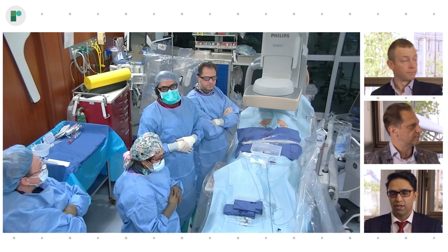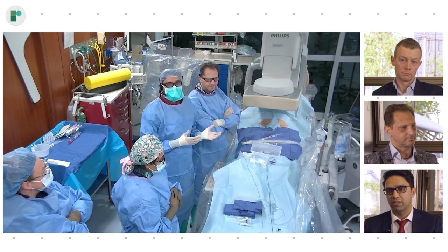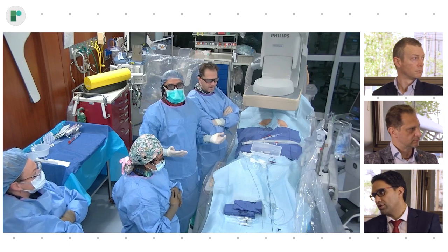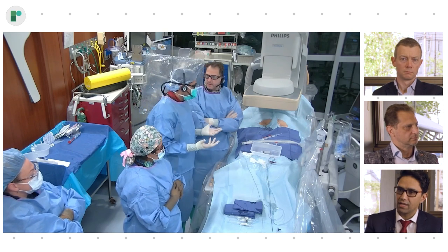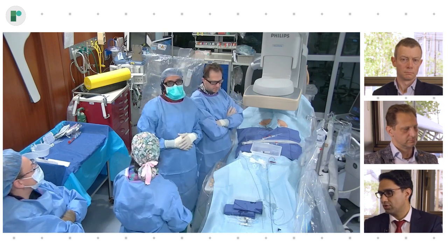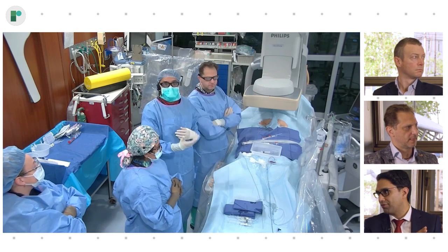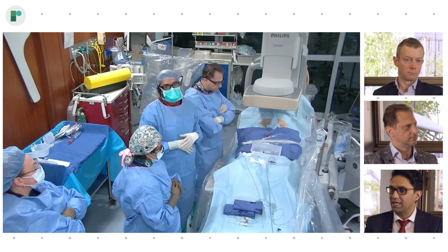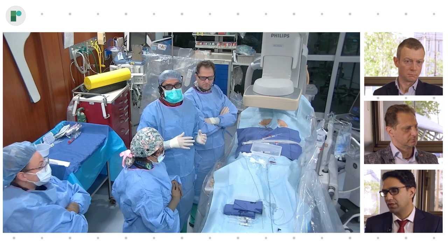Ziad, any comments? Great, yeah, that's a great introduction. I think it covered some of the key points that we're going to talk about. The key points were that the contrast volume to eGFR ratio of less than 1 is your absolute contrast limit. We usually separate the diagnostic procedure and the interventional procedure. And then when we do the interventional procedure, we use the information that we got from the diagnostic, and don't do other injections. The staging has some potential benefit because it gives a washout period, and we typically do about 7 days.